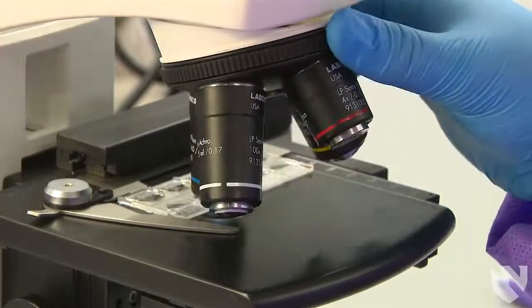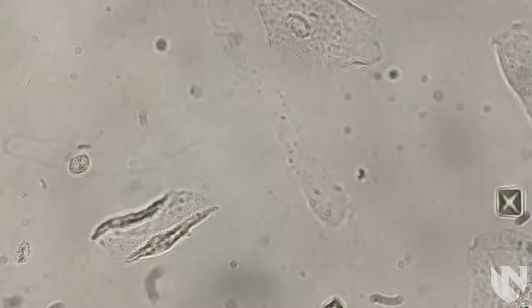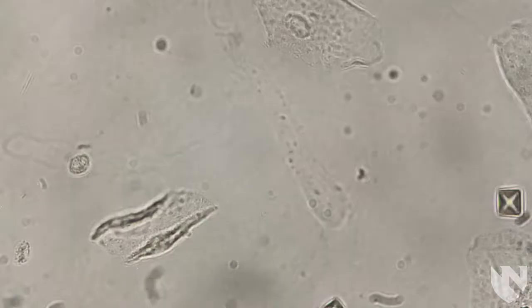If you are unsure of what an element may be, you can examine that element on the 40x objective, but remember you must quantitate squamous epithelial cells, casts, and mucus on low power.